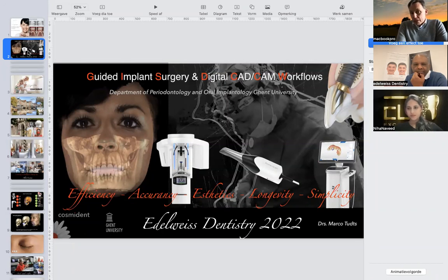In these cases, we did the face scan with the face scanner from Zirkonzahn. This is a special tool which you can use to do a face scan. But Planmeca also has, and more companies have it, in their high-level CBCTs the option to get a face scan inside.